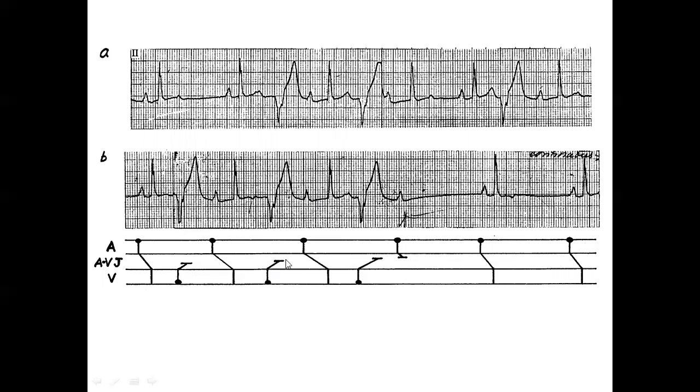It has a further penetration, so the next beat takes even longer. With further penetration, the next beat is just not able to conduct. So during ventricular bigeminy, among the sinus beats, there could be a Wenckebach phenomenon. But this is not a primary conduction problem. This is retrograde conduction from the PVC, rendering the AV junction progressively more refractory, so that the next beat conducts with a longer PR interval, then is eventually blocked.